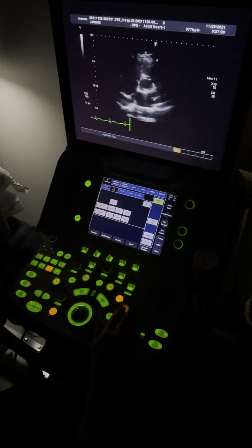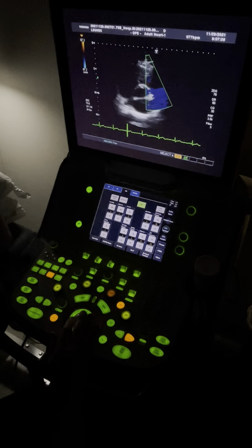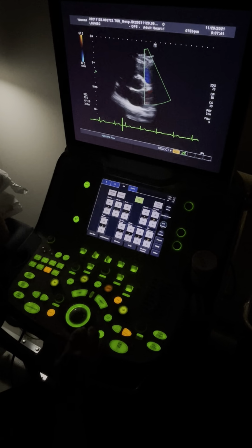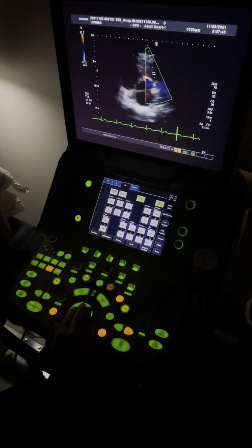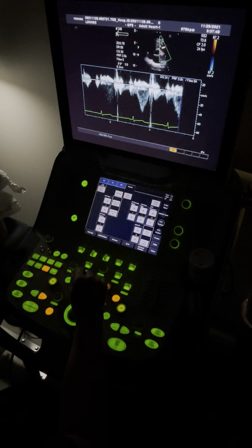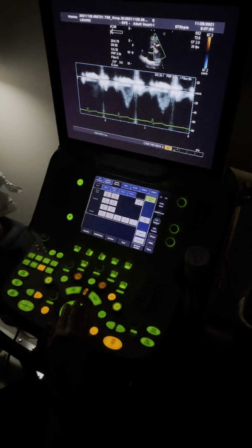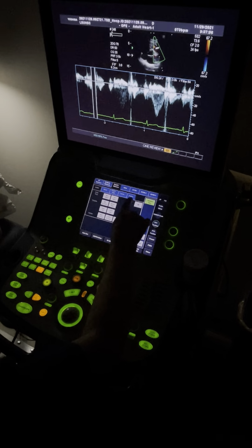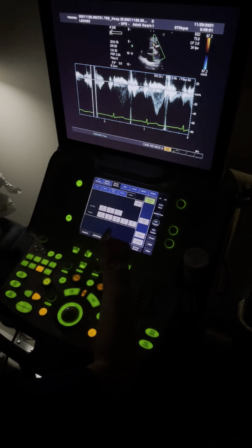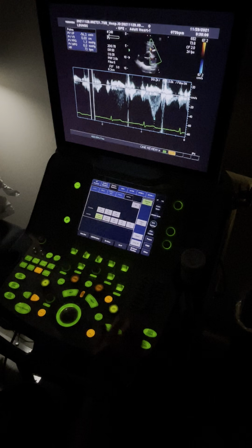Then I'm gonna roll over here to the pulmonic valve. Call out my cursor just before the valve, pulse wave. It's on the Pulmonic page. PV trace, go to the peak, double set, or you could just get a caliper, that will work also.